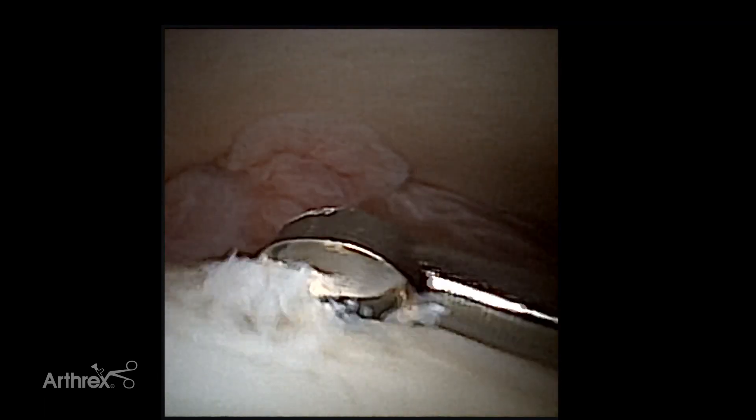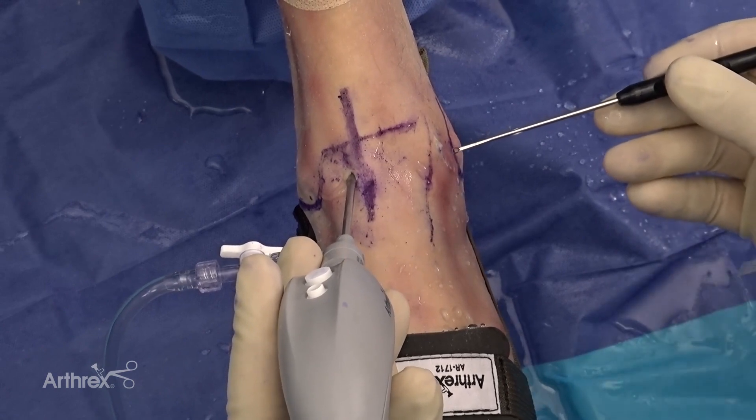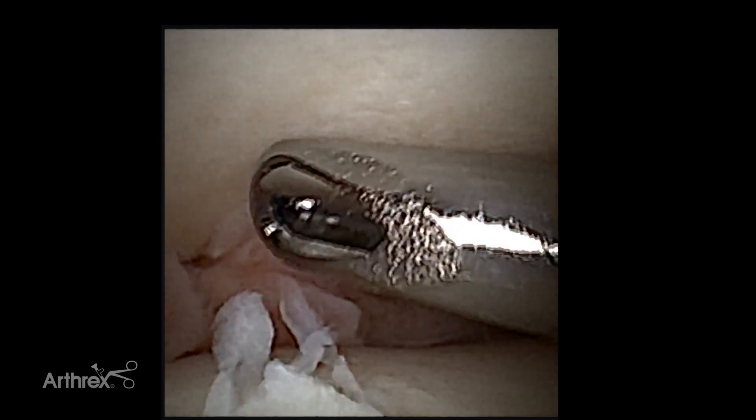Once you've excised the osteochondral defect in the talar dome and removed the injured cartilage, go back and forth using the shaver. The 15-degree ring curette is another excellent option — because it is a single-use curette, it has extraordinarily sharp edges, which allows you to harvest and treat the osteochondral defect with very sharp borders. Once done, insert your shaver back in with the graft net attached to further collect the remaining autologous chondrocytes.